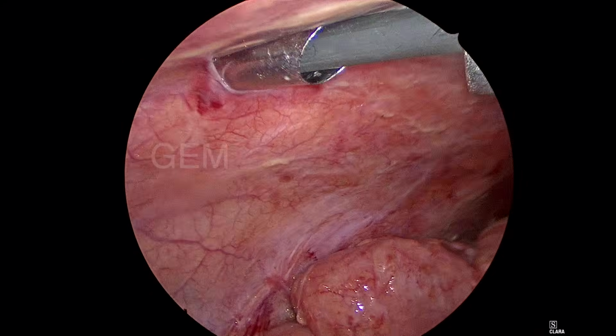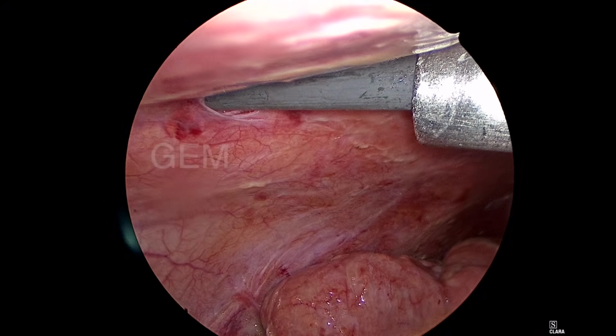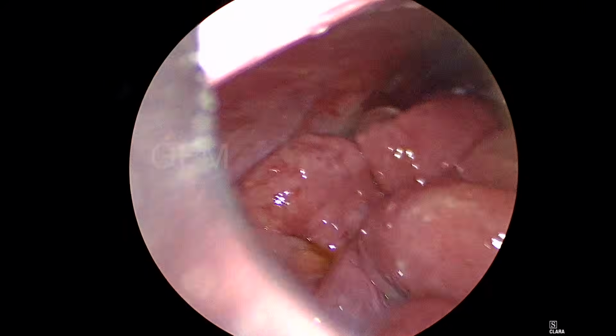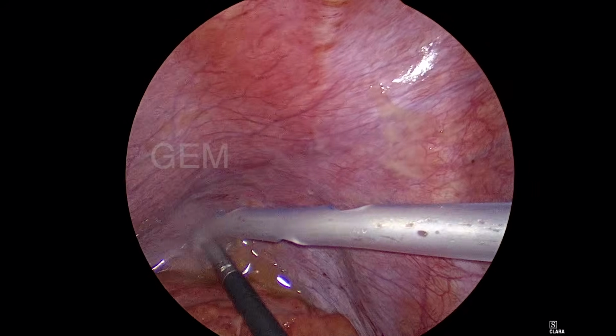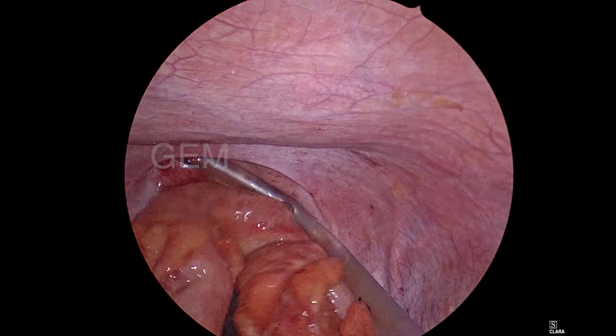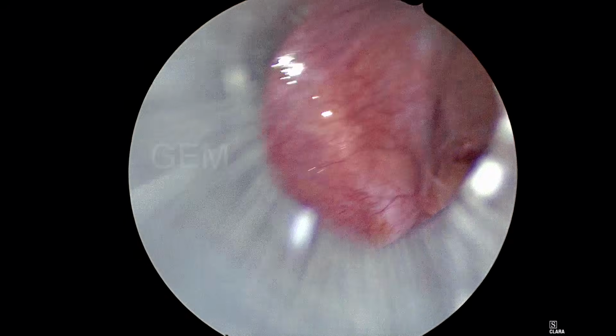I'm keeping a drain. Drain means some pus fluid might collect between the ileum or the mesentery, so I'll keep it for one day. Once the bowel starts functioning and the patient starts passing flatus, then I'll remove the tube.